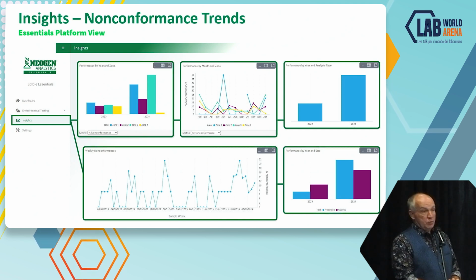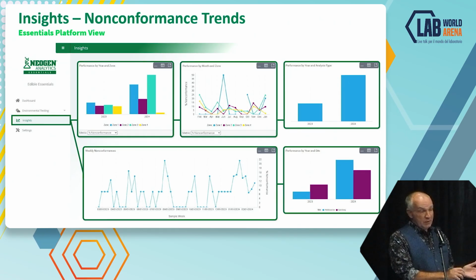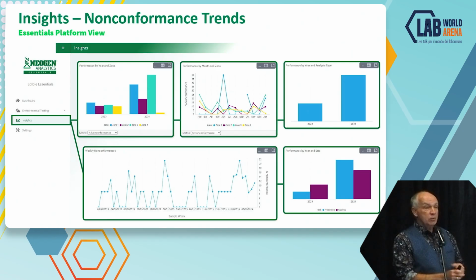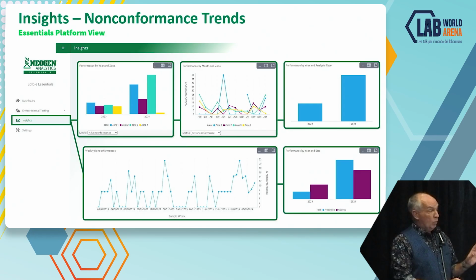One pathogen result will not drive you into a panic mode. Should not. But if you see more and if you see some increasing results, at the same time you see increasing total count results or increasing EB results or listeria results, you know something's going on. I need to react here. And looking at the data, you can have a very early warning and you can start to react.